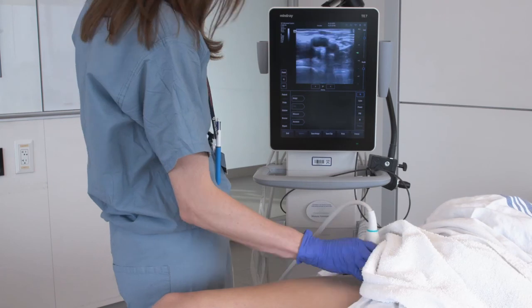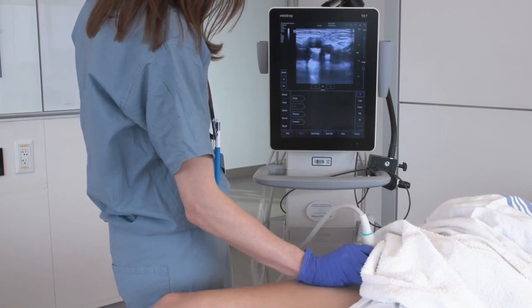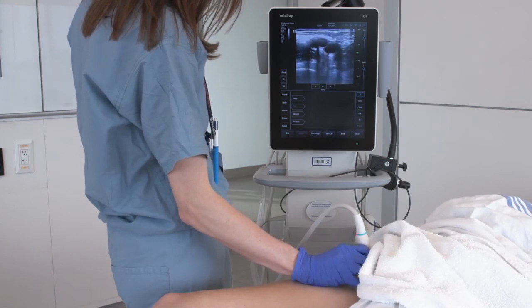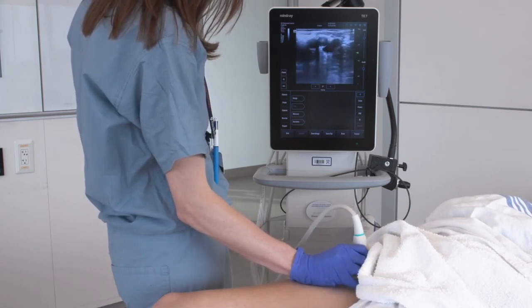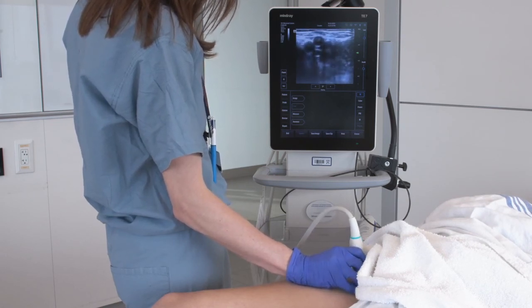Here we see normal compression of the femoral vein, normal compression of the great saphenous vein, and then normal compression of both the deep femoral and femoral vein. These veins show normal compression and are therefore very unlikely to contain DVTs.